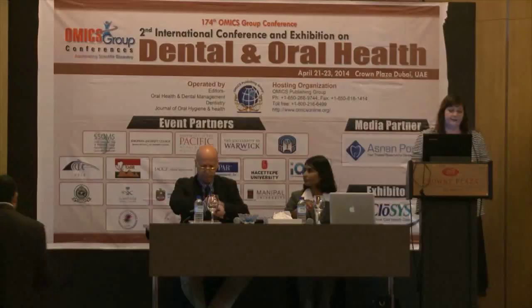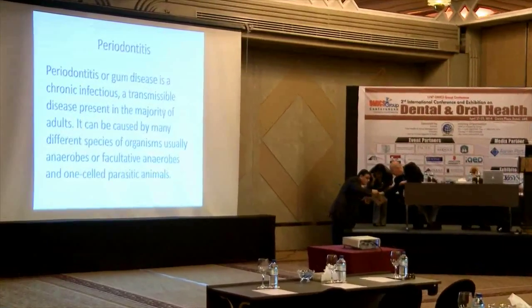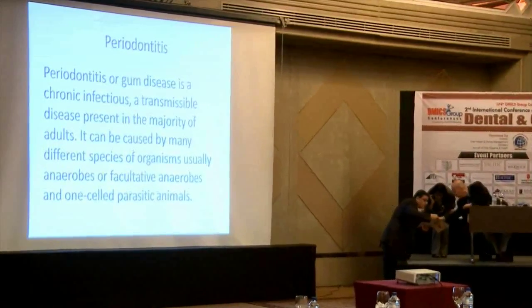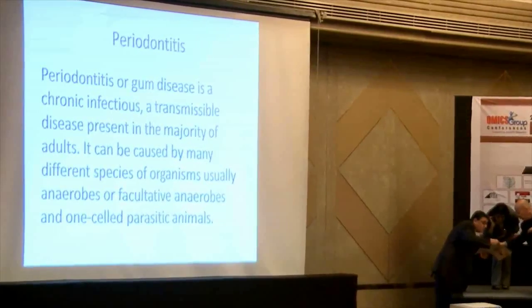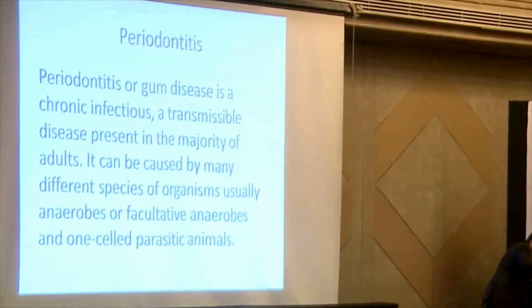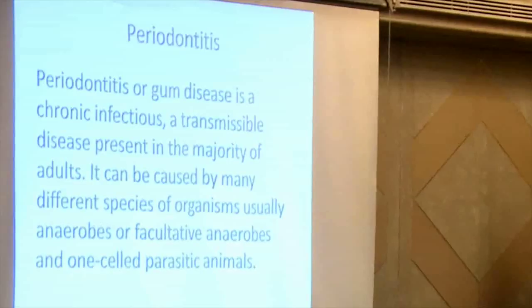My topic is on the phase contrast microscope used in dentistry. I'm a dental hygienist and I was able to use the microscope in 20 years of clinical practice. So this is what my experience was using the microscope. The phase contrast microscope was first built in 1938, so that we were able to see live microorganisms in their natural state.